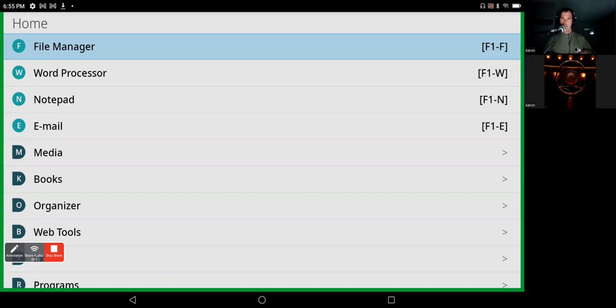emails and things that I can do on my phone, I've dedicated now to the Braille Sense, such as email, Zoom calls, Teams, a lot of stuff that wouldn't necessarily need a computer. I can now use with the phone for that mobile communication. I can now have the Braille Sense do that as well. And it is running Android 10, which is pretty recent compared to other competitors out there on the market.